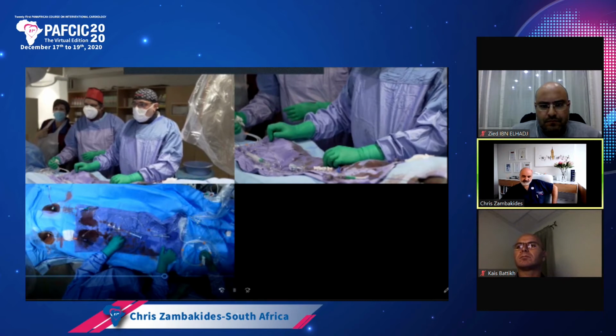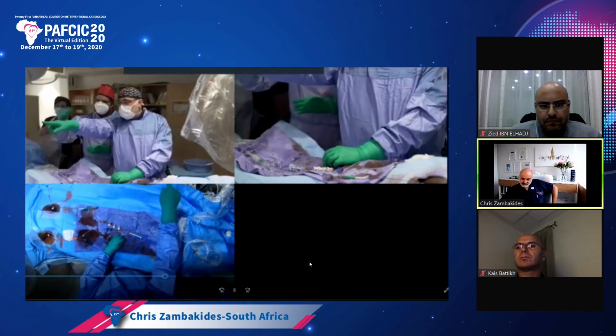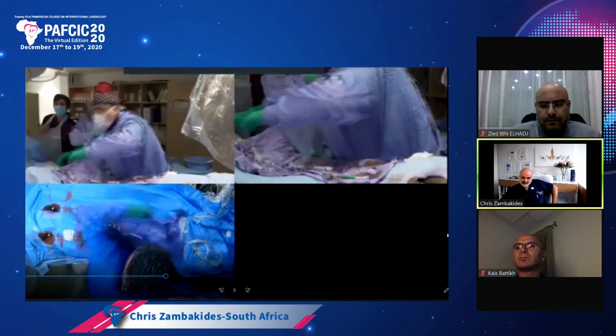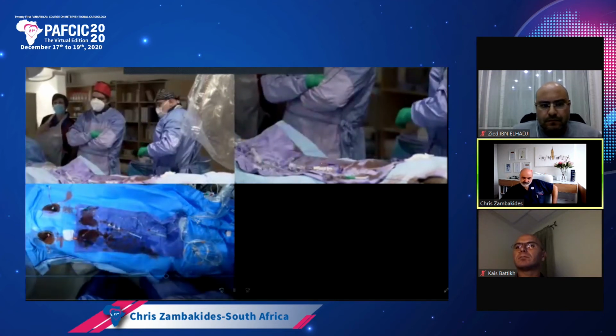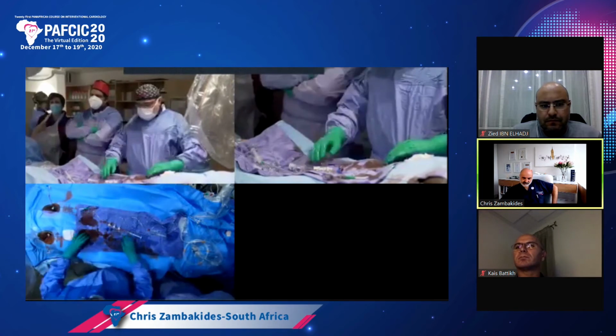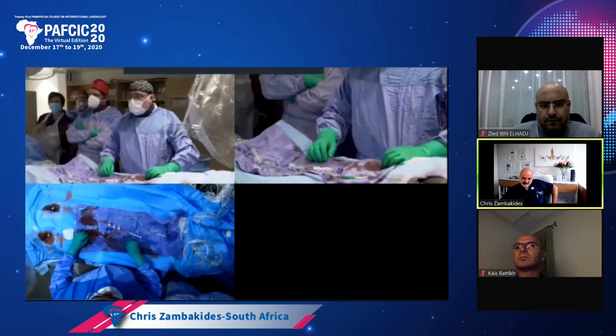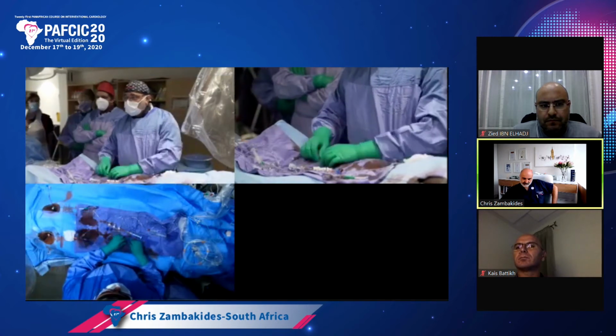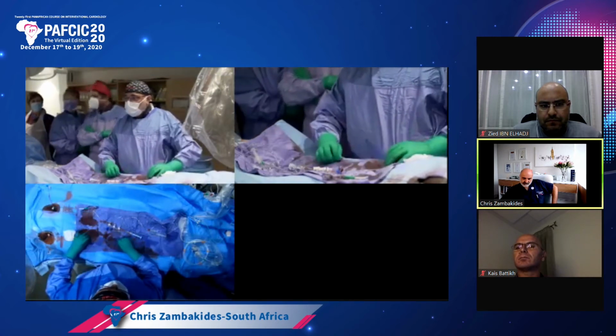Okay, so we just passed the bifurcation. Can you see there? Yeah, but can you see the bifurcation is there? Yeah, so we passed the bifurcation. So if I can get the Pro, the microcatheter, a little bit further in.